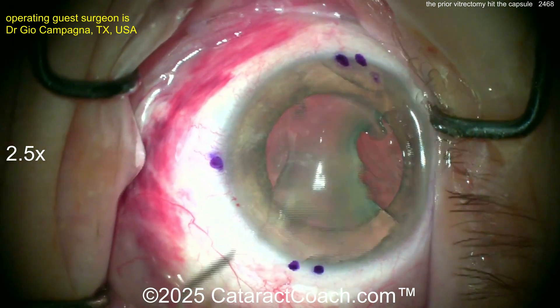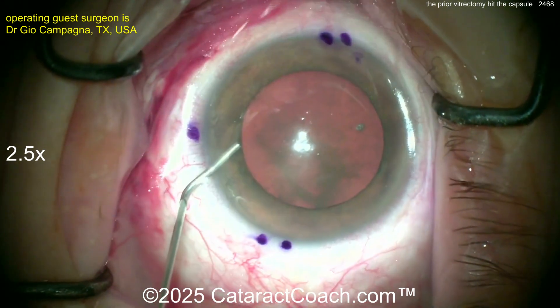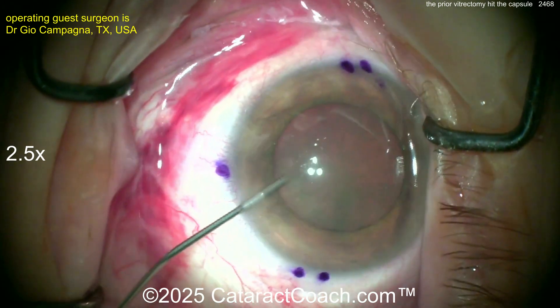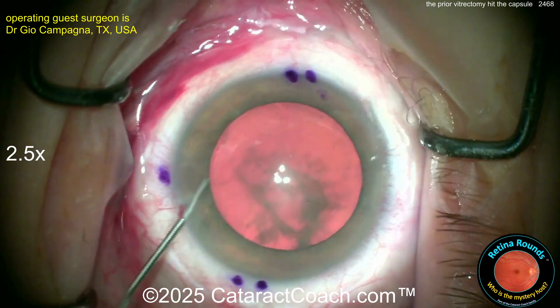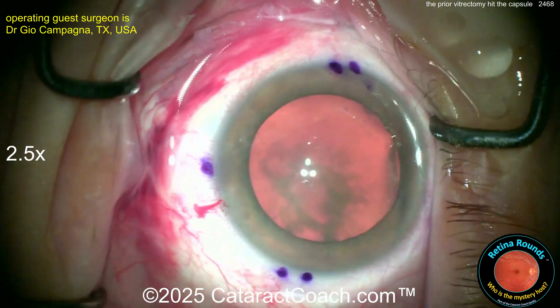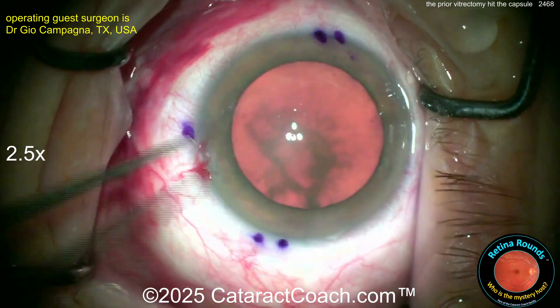The patient had damage there — you can see it on the posterior capsule. Very important to check that. The patient had four prior vitrectomies. First one for a detachment, then had another retinal detachment, and therefore had a repeat vitrectomy and scleral buckle, then had a third vitrectomy for silicone oil to be placed inside the eye, and then had a fourth vitrectomy to remove the silicone oil.